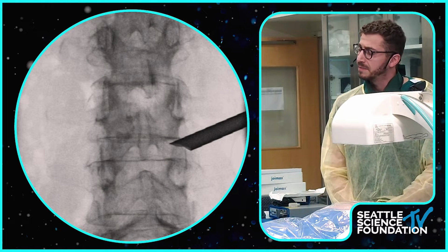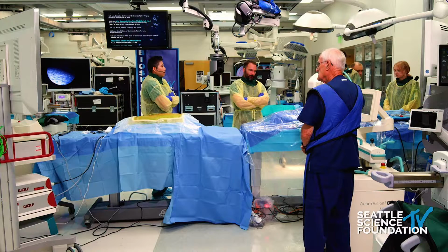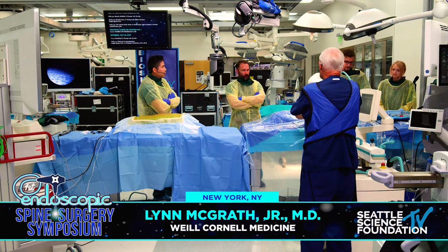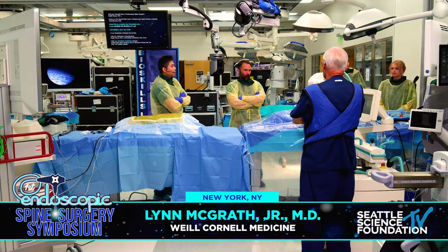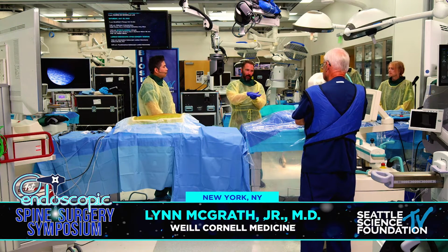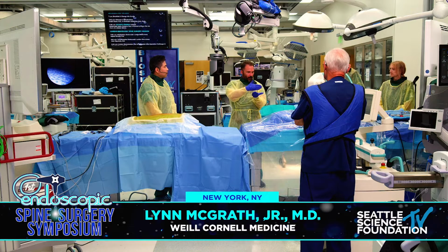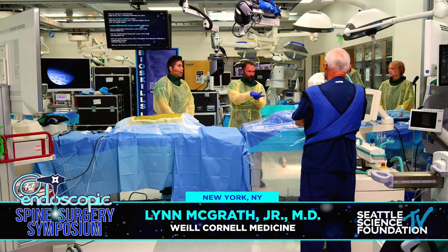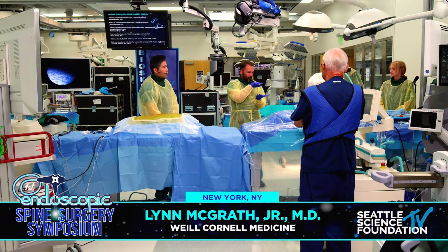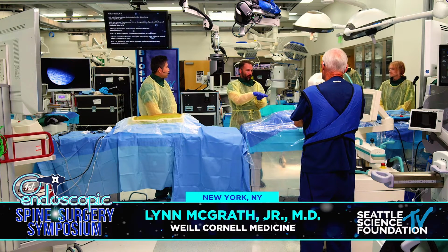Yeah, I do the same exact thing, mark 3 lines, just to get a general sense for where I should be, kind of a reality check. Then I use that same technique if I'm going to use fluoro, where I'll see where the level of the spinous process is on a lateral, and as long as I feel like I'm in line with the tip of the spinous process, that's another way for me to confirm that I'm at a good lateral entry point.